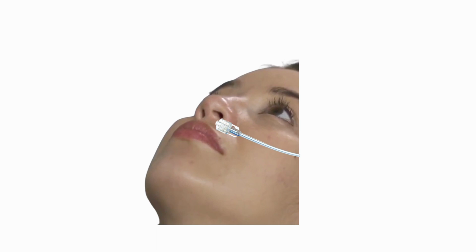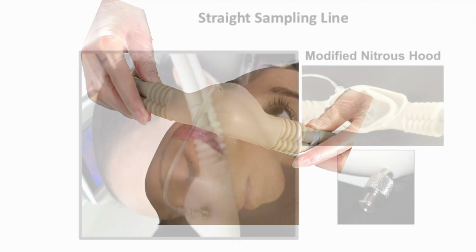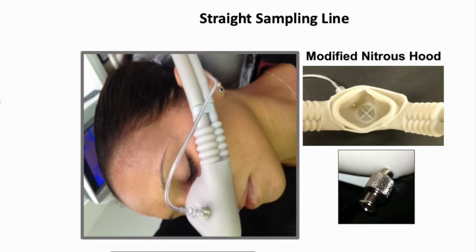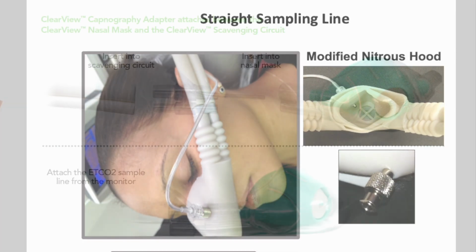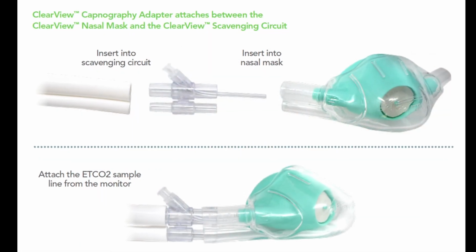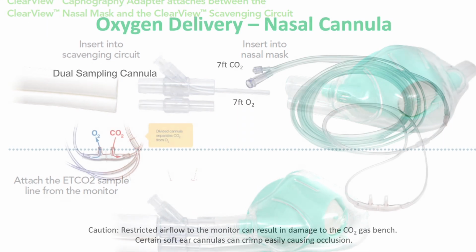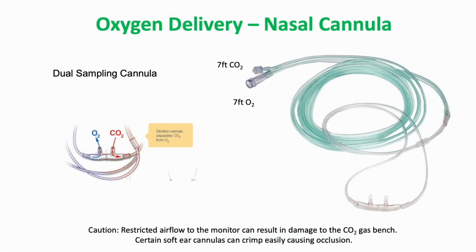Another option is to tape in place just under the nostril the end of the straight sampling line. Alternatively, there are methods of modifying a nitrous hood to use a nitrous hood adapter as shown, or using a disposable adapter in line with the tubing. If you deliver oxygen through a cannula, a dual sampling cannula that allows delivery of oxygen and sampling the CO2 through the same cannula can be used.